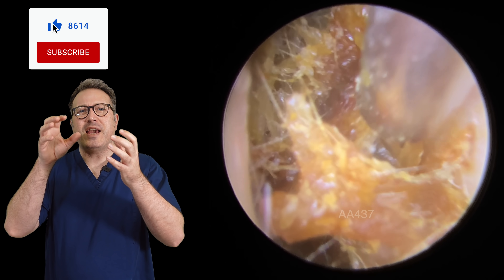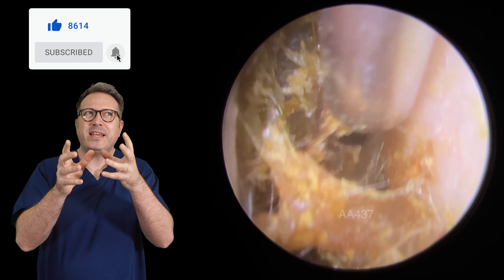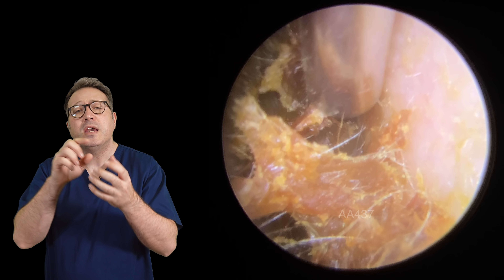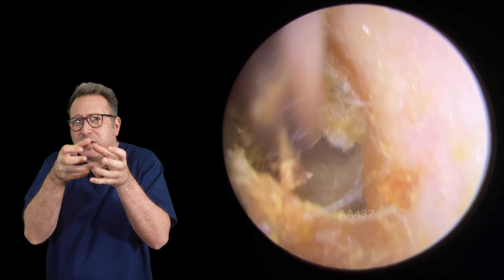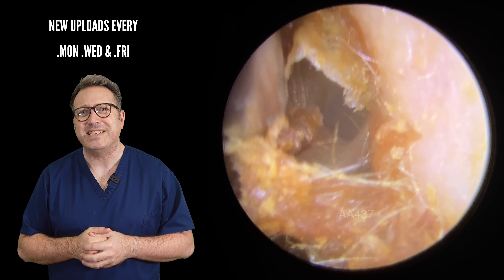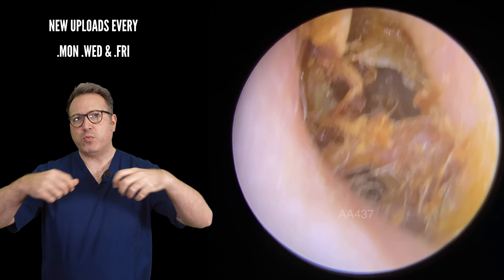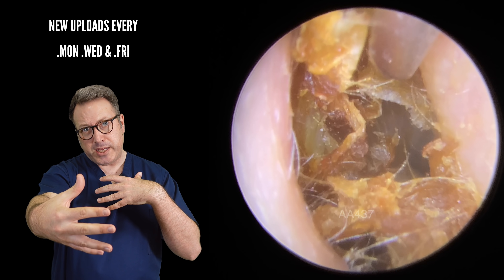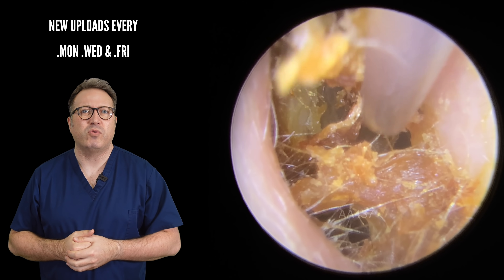I'm trying to use the standard size on the tube to bunch all this together, a bit like what we did with the hairs in the wax that we took off the eardrum on Monday. We're trying to bunch it all into the end of the suction to get a really good grip and draw it out from there. But it's difficult because it's all stuck so firmly to the canal walls, and these long strips of skin are going to hold on quite tightly.